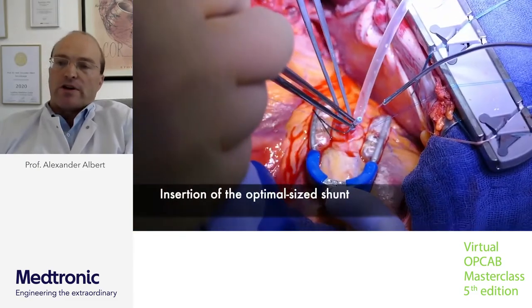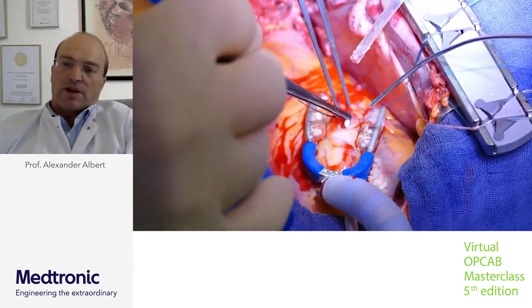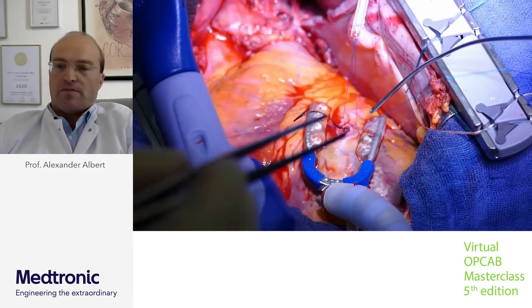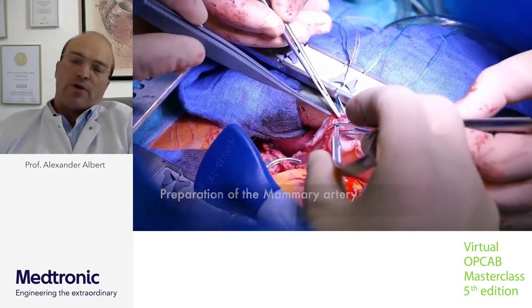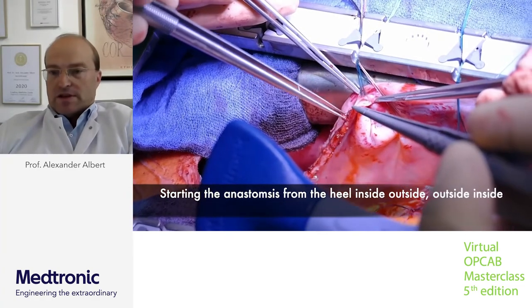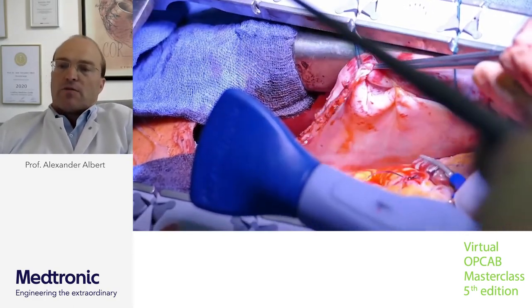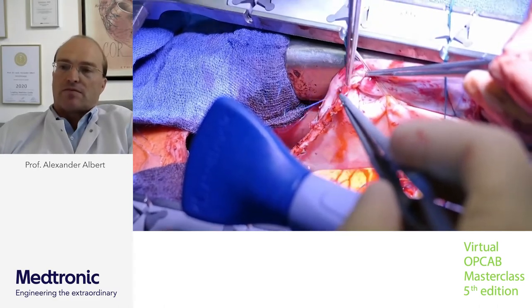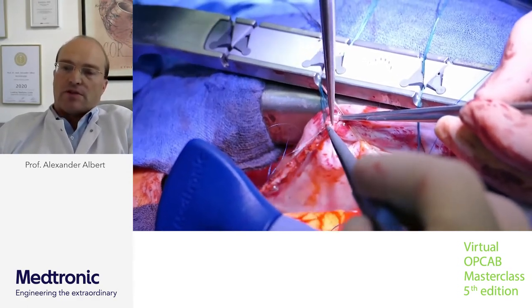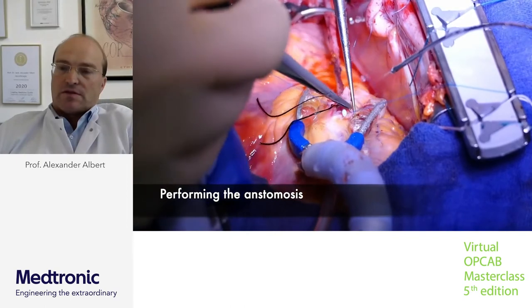We open the coronary and insert an optimally sized shunt. The larger the shunt, the better the flow, and the less blood accumulates between the shunt and the coronary. We then prepare the mammary artery for the anastomosis. We always start at the heel with a stitch from inside-outside, outside-inside. We bring down the mammary artery and perform the anastomosis as precisely as possible. We mainly use 8-0 suture; for the MIDCAB procedure I use 7-0, because there is a high risk of damaging the suture.